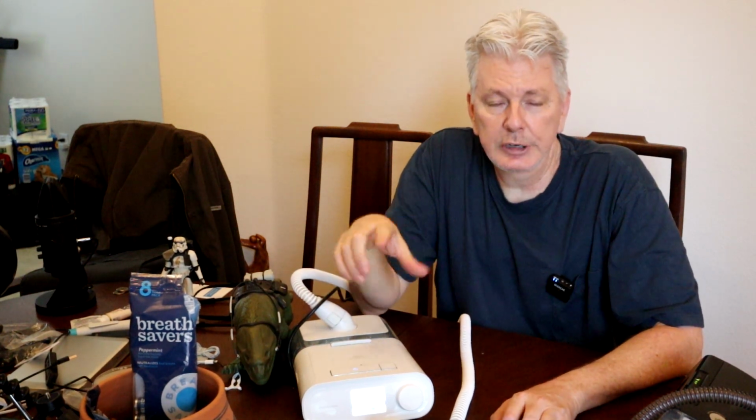Okay, the ResMed, you take no more than 2 breaths and it kicks in automatically. The Philips is a little fussier. When you put the mask on, you could tell, if you were watching a second ago, it took a minute for it to really start to go, and I had to press the power button. It does start automatically, but sometimes it's a little finicky. If the seal isn't right or whatever, you just have to hit the power button and it kicks in.